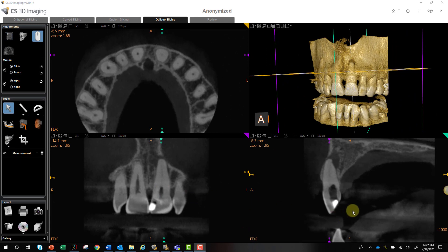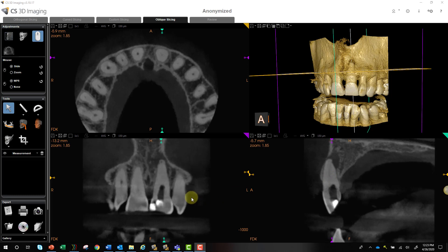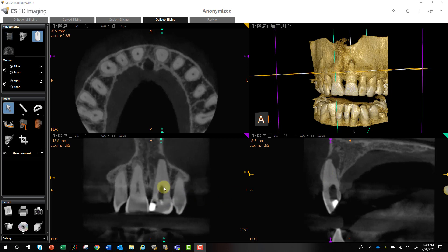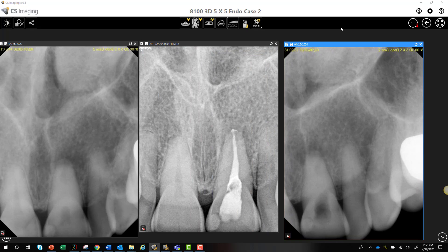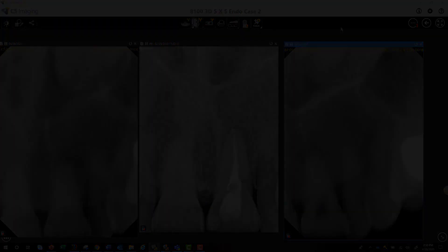So now all you have to do is go to the most facial aspect of your access, where we can see the actual canal begins, and go to the most mesial aspect of our access as well, and we should be able to find the canal very easily. And that's exactly what the endodontist did. I'll show you the final PA, which was taken on the CareStream 6200 sensor.